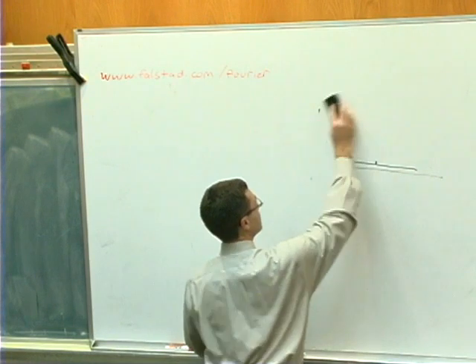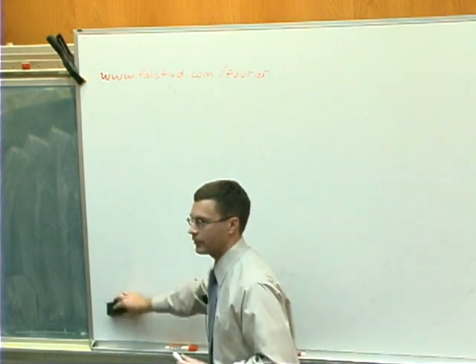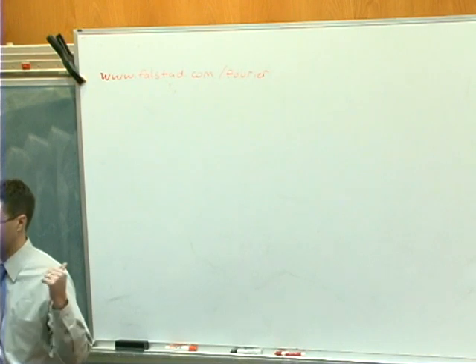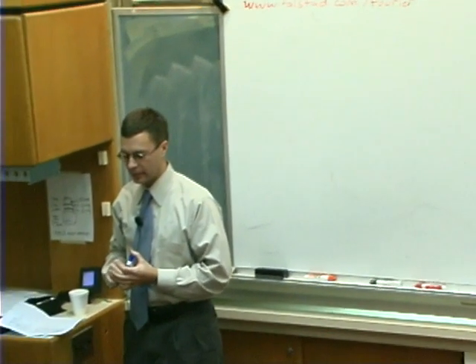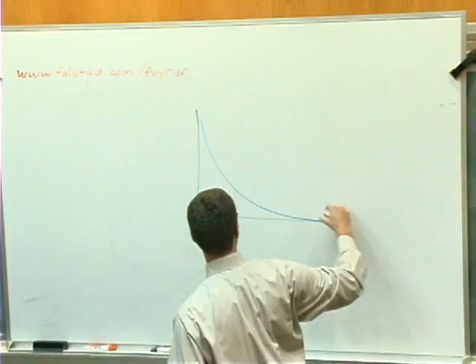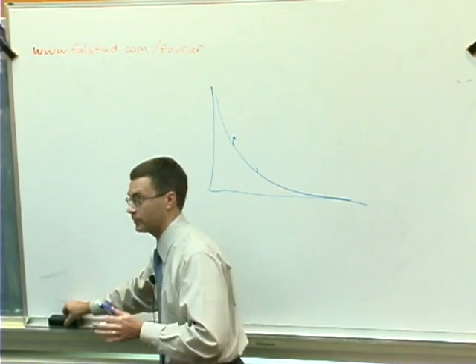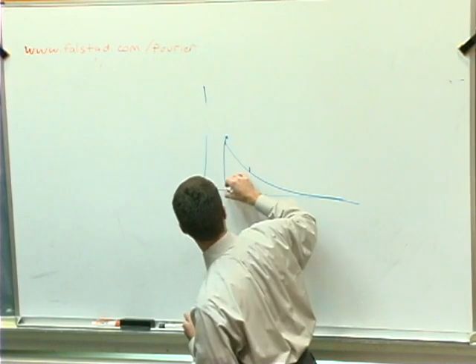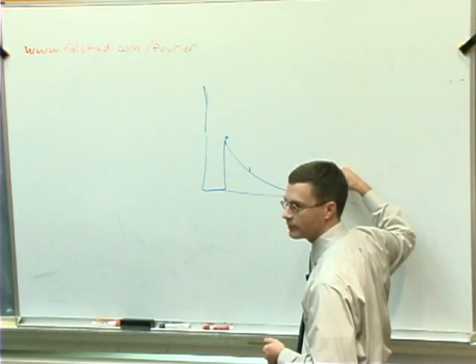So, basically a variant on a low frequency filter. What's done in the analysis? No, it's not exactly the same. Although we do apply a high pass filter in our analysis at a point, it's a little bit different. For example, if this is the noise power spectrum, and here are the task effects, and we just did a high pass filter, which we actually do, for reasons that I'll talk about in a moment, and just digitally filtered the data so it looks like this, you still are stuck with having to take into account the decelerating function that you have up here.